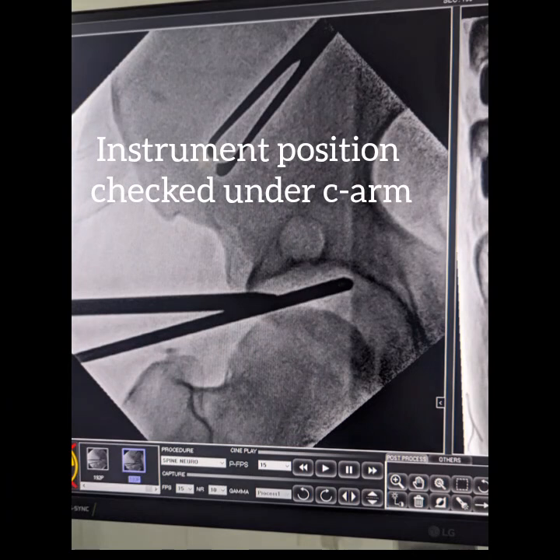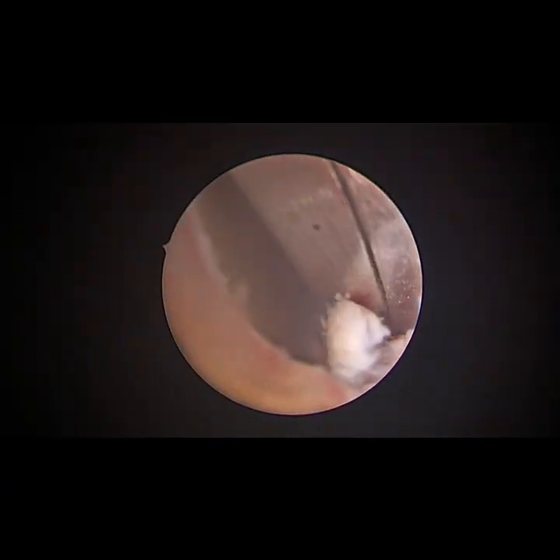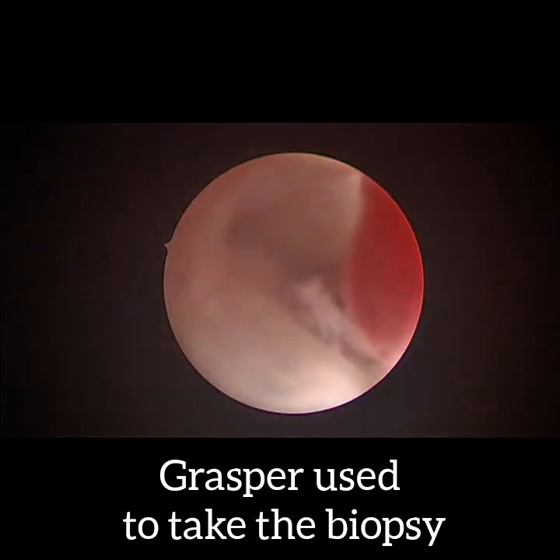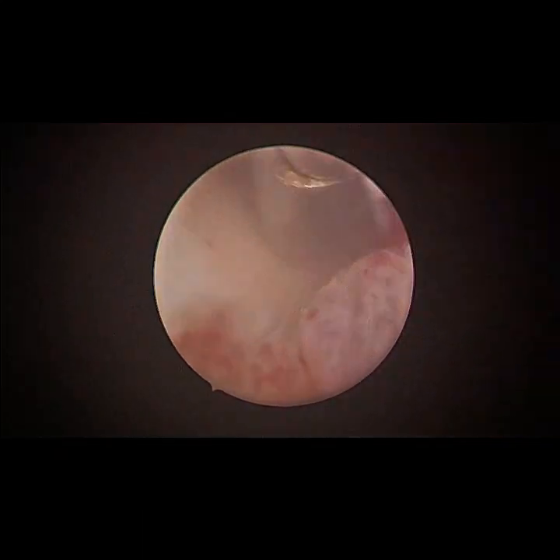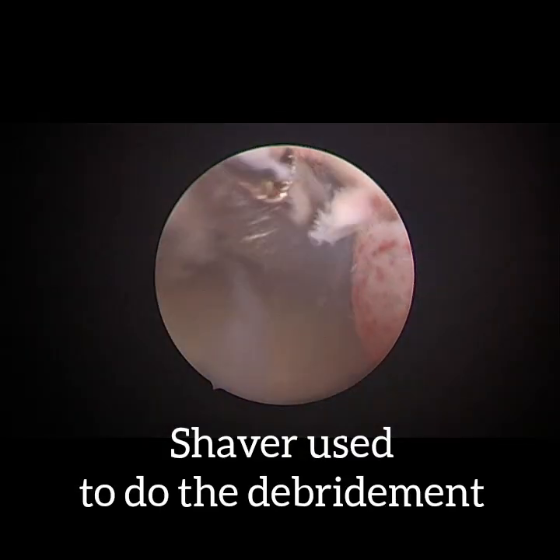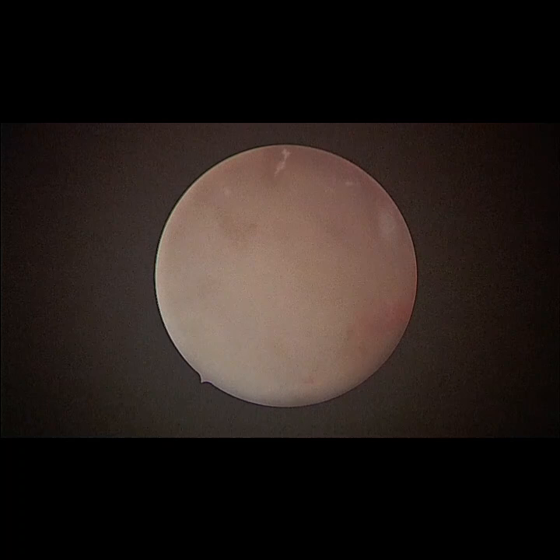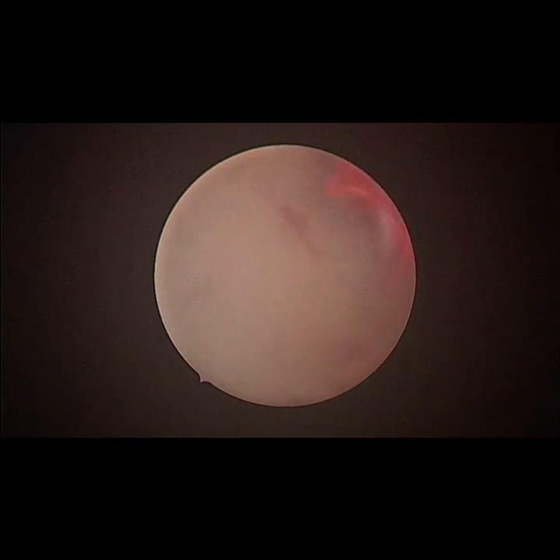We check our instrumentation via C-arm. Taking our grasper from the modified anterior portal, we take biopsy from synovial tissue as well as from the capsule. Then we introduce our shaver and we clean and debride the hanging synovium or the thick tissue. We make sure our whole hip joint is clear and all synovial tissue and thick capsule is properly debrided so that there is no impingement.